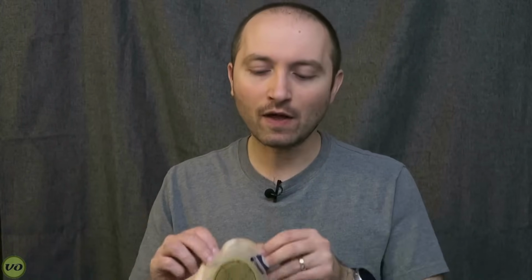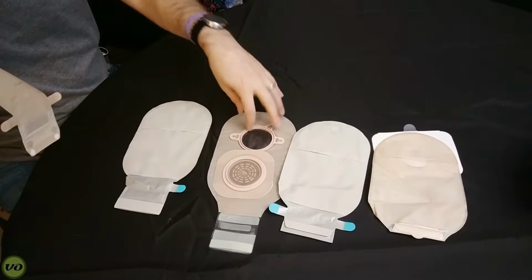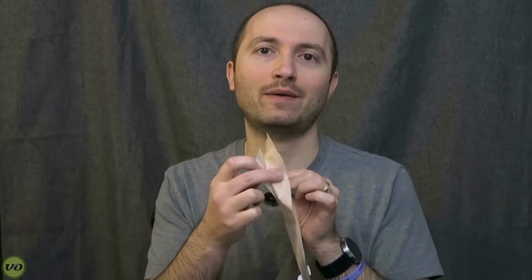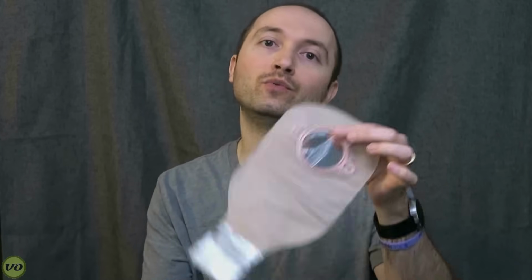Now, you'll notice one thing on the one-piece system that you tend to see on the two-piece system, and that's the fact that they don't have the belt tabs. Now, that's because on a one-piece system, really, you're not going to have a risk of that bag detaching because it's all fused together. And that's usually why you would have the belt tabs on a two-piece system.